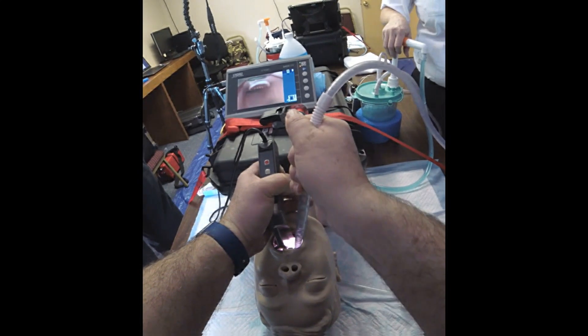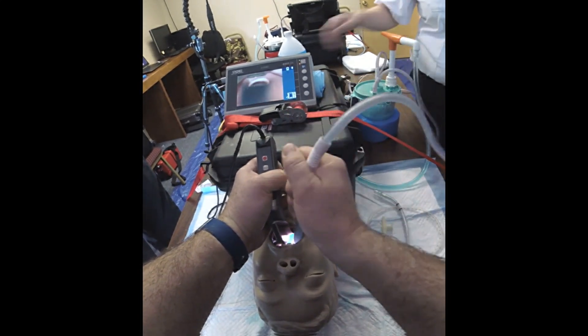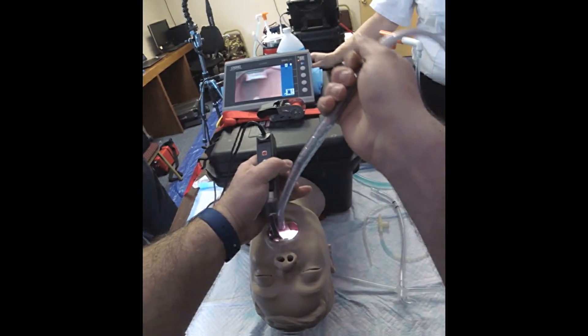Decontaminate the hypopharynx pretty well. Two more pumps. Yeah, there's more in there. It really upsets me.